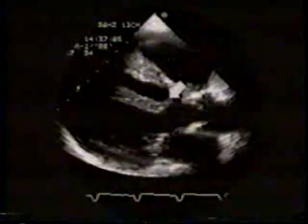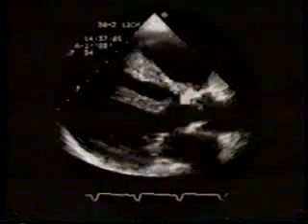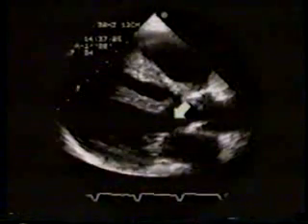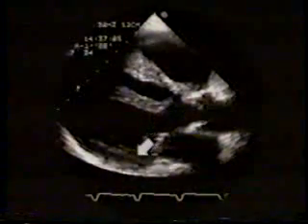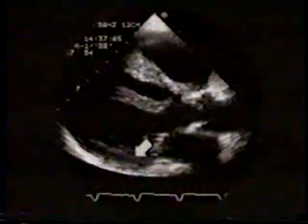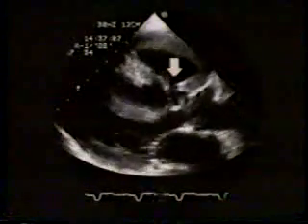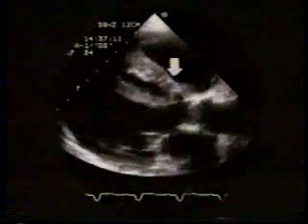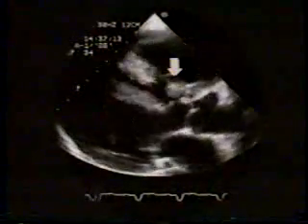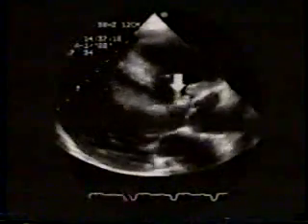Note here the presence of a large perimembranous ventricular septal defect. Left ventricular outflow tract is widely patent, and left ventricular cavity dimension is normal. Watch these features in real time now. In real time, you can also appreciate that the portion of this redundant tricuspid apparatus is prolapsing through the ventricular septal defect.